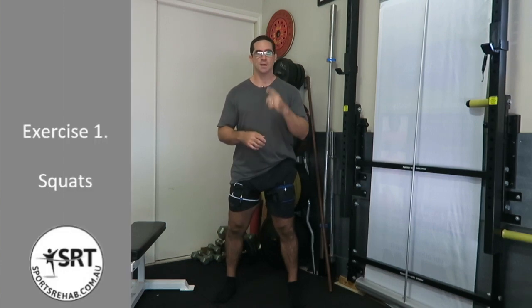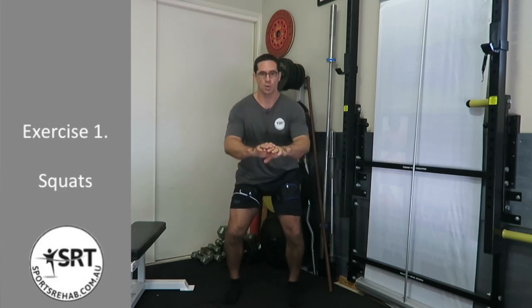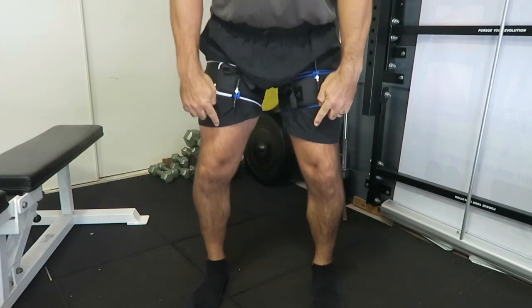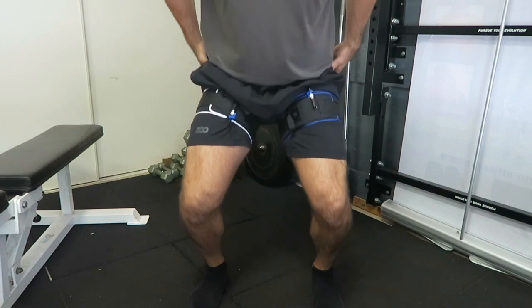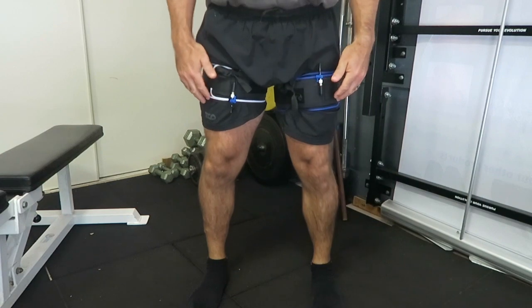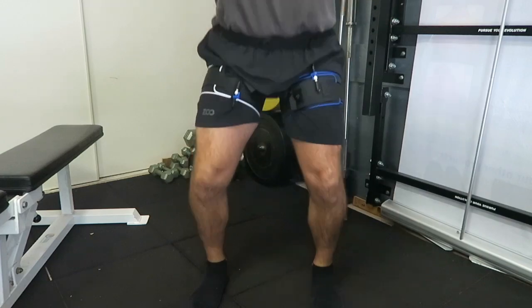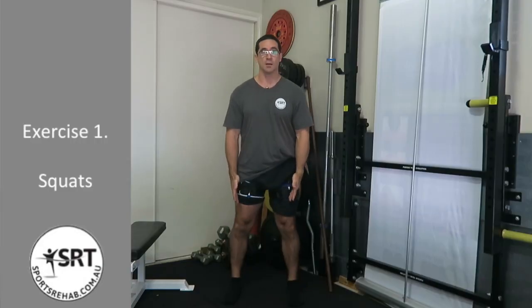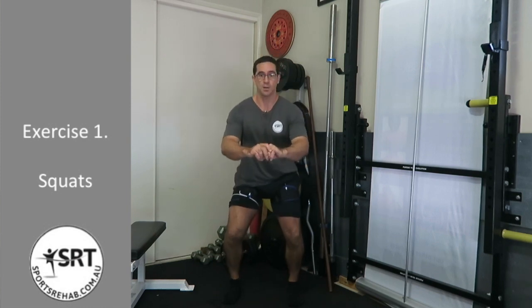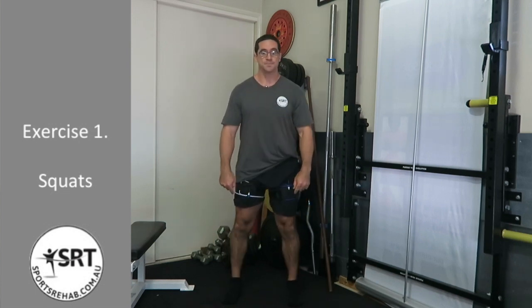So 4 exercises here. The first one is a double leg squat. I'm just going to work the range of movement that I'm comfortable with, and that's the beautiful thing about blood flow restriction: you don't have to use a huge range of movement. However, when I'm coming up, I'm trying to get a co-contraction between my VMO and my glutes. I'm spreading the floor slightly, making sure my knees travel in line with my toes or my second toe, and really thinking about squeezing those VMOs as I'm coming out of the movement. I'll aim for a set of 10.